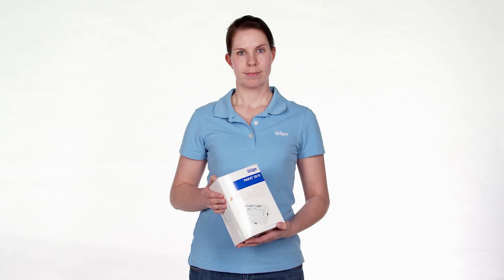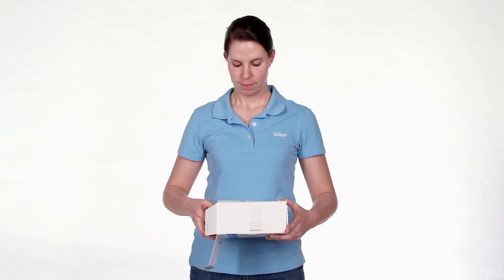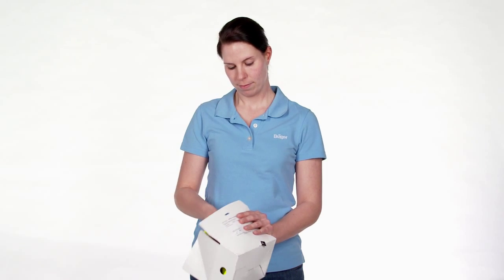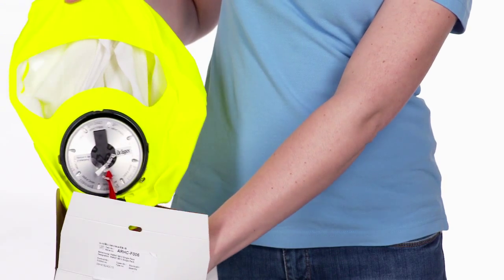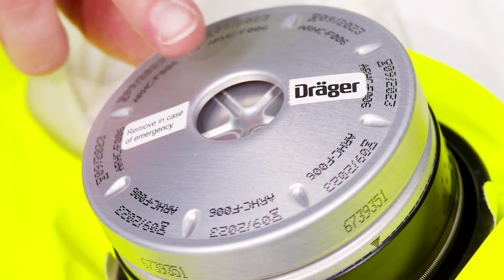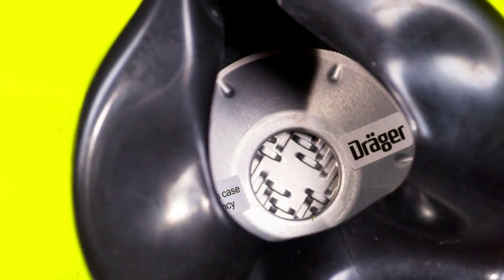In the case of an accident, the Draeger Parat escape hood in the single pack can be easily opened, removed and donned. Open the box and remove the inner cardboard box, then remove the hood from the cardboard box. Grip the red pull cords with one hand and use the other hand to pull on the escape hood until both filter sealing plugs are removed from the filter. The filter openings must be free to ensure unhindered breathing.